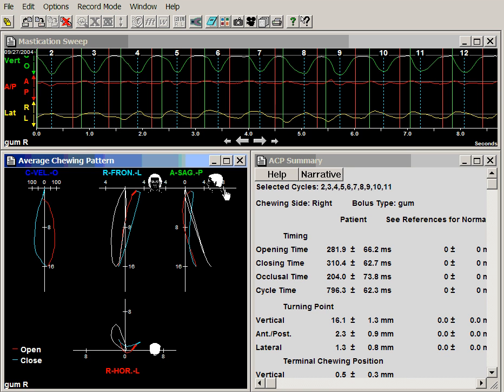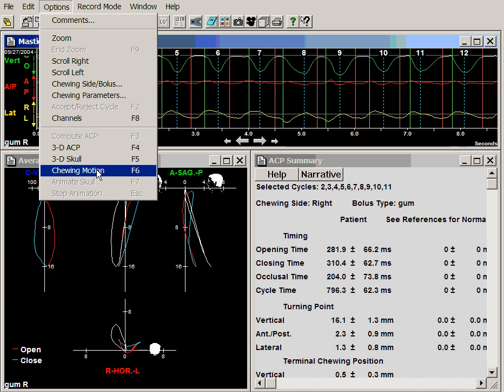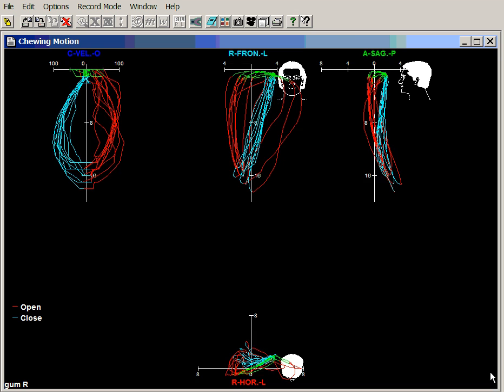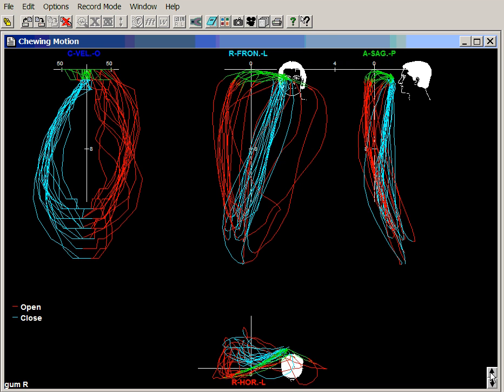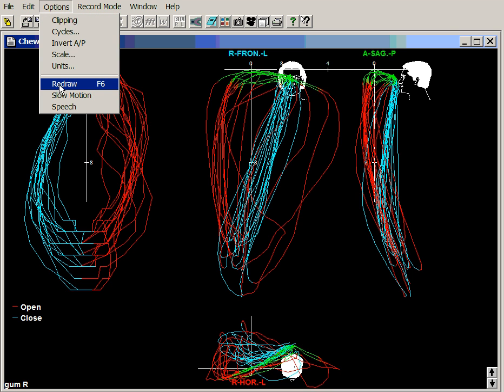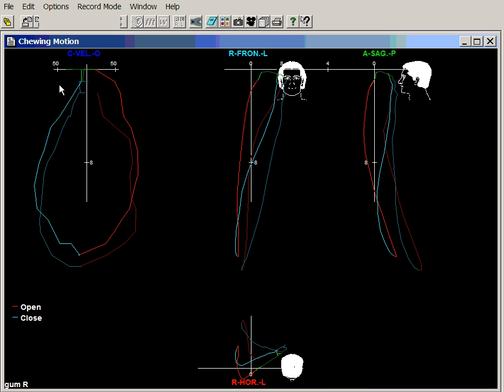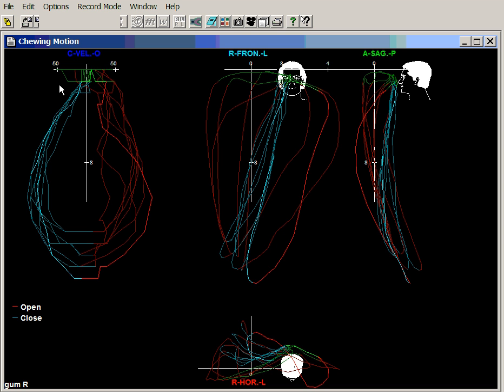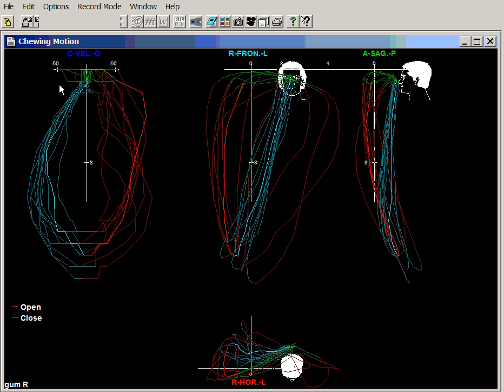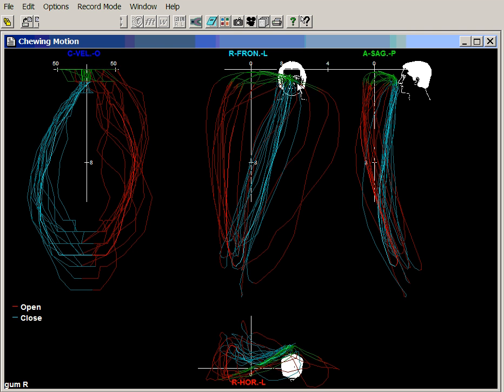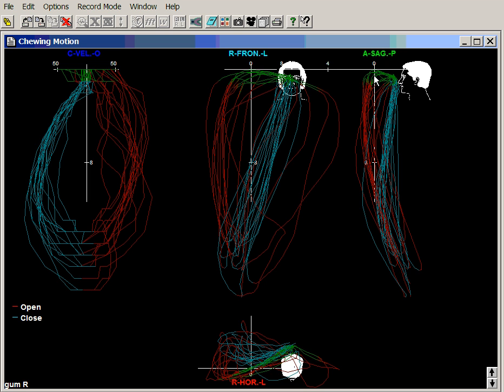If we open a chewing motion view, we can see that the movement is quite unusual in that it shows very little cuspal guidance in any direction — not in the lateral direction and not in a protrusive direction.